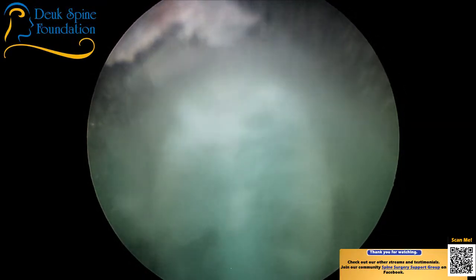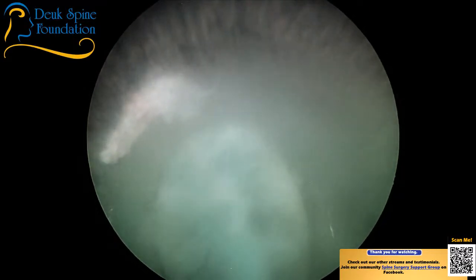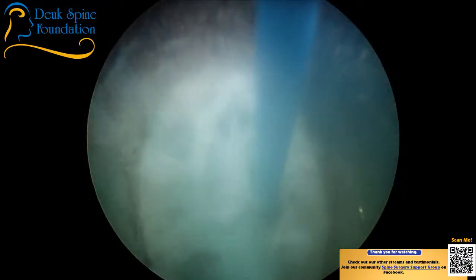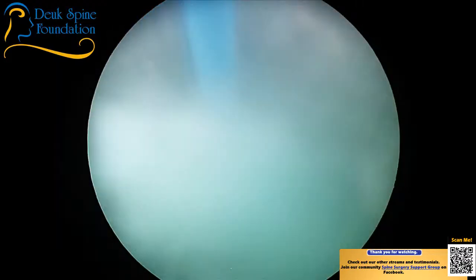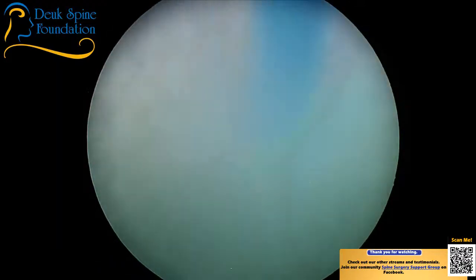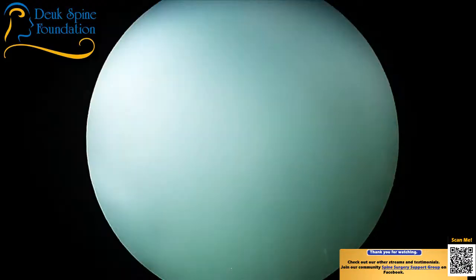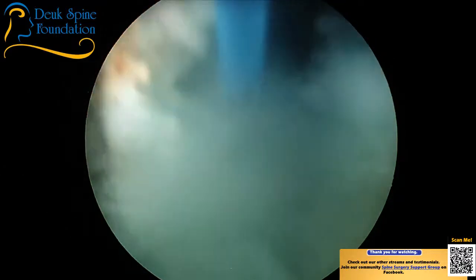And it's stained blue. Now, I just passed the instrument through the tear because that's the beauty of this surgery too, is that we don't damage normal parts of the disc. We go right through the tear because we come right through the herniation. The herniation comes out the tear. So we basically go in and push the herniation back through the tear, and then we take the herniation out from inside the disc. That technique was taught to me by Dr. Anthony Young, the removal of the herniation from inside the disc to outside the disc technique.